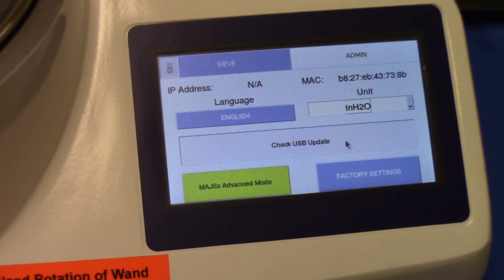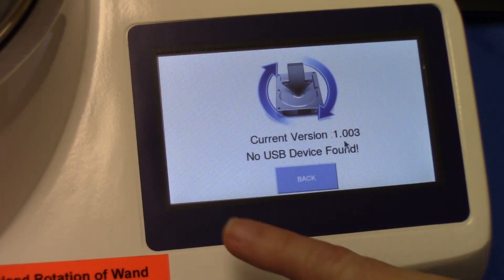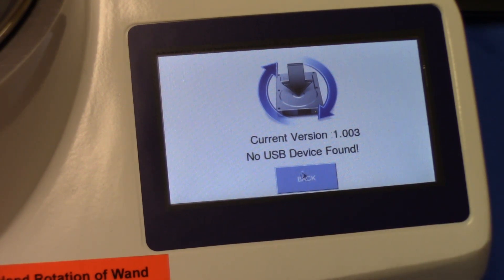The next button allows you to check for the latest version of the software. Clients often call to confirm their software version or ask whether they need an update. If a USB stick were inserted into the back of the unit, it would compare the installed version of software versus the version on the USB stick. As you can see, no USB stick is found, so we'll go back.